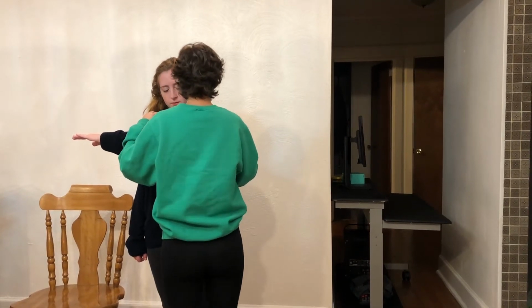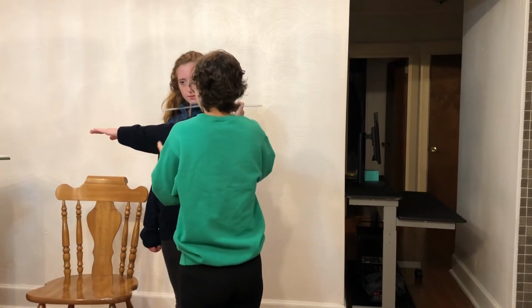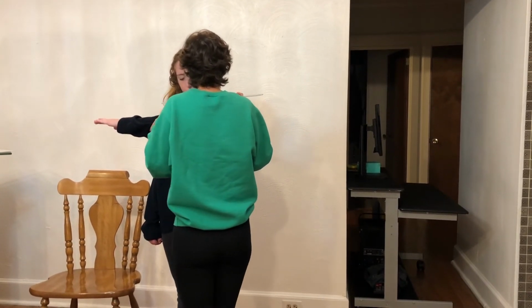Okay, so my patient's able to get 126 for horizontal adduction. I'm going to see if I can push you a little bit further. Okay, now that's getting us to about 130.